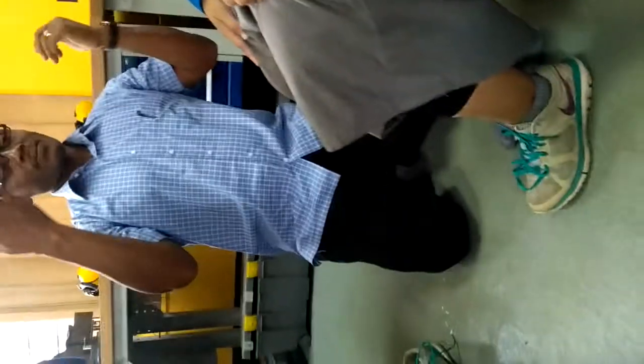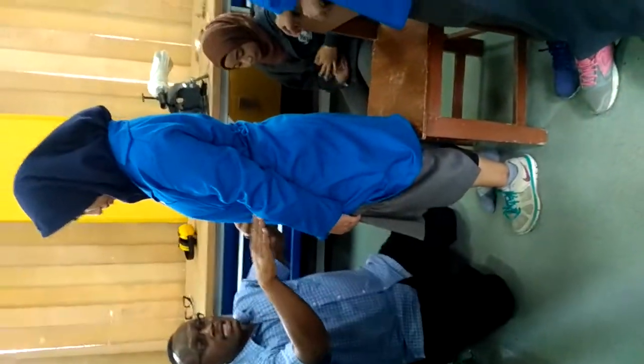Then I can ask the patient to stand up. Before asking for dynamic, I am going to check height — if the height is equal. And then also: how do you feel? Do you feel comfortable? Do you feel any pain? If there is no pain and the patient feels comfortable and height is okay, then you can do this walk. Then you can go for dynamic.